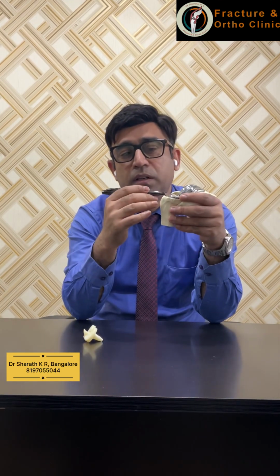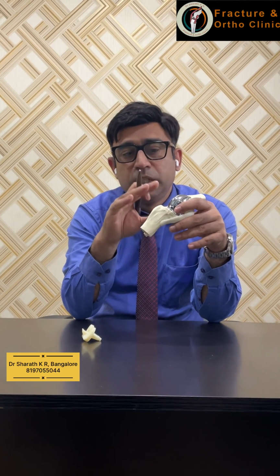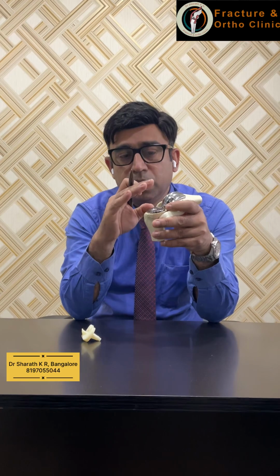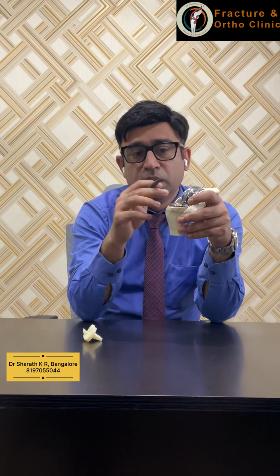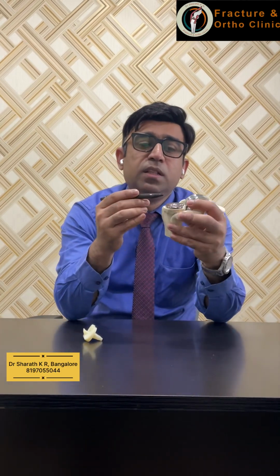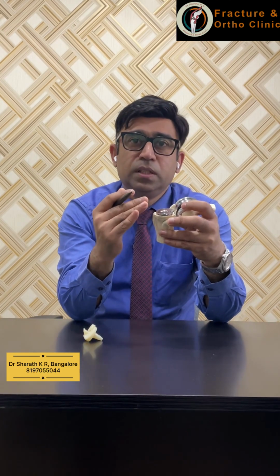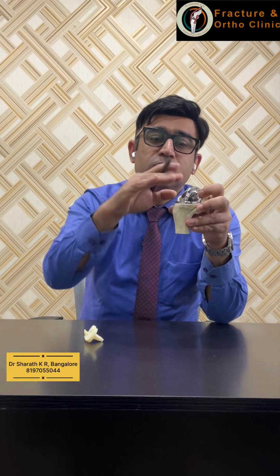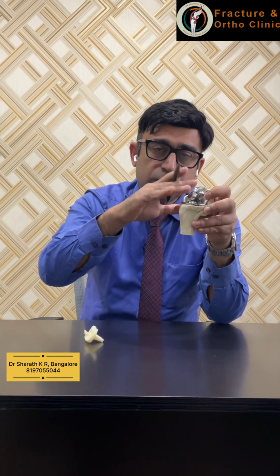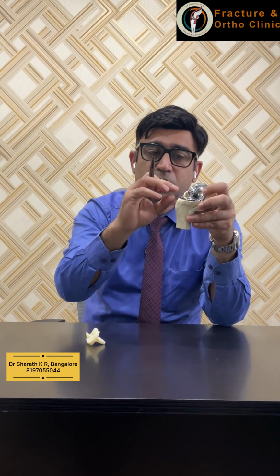We do something called resection of the bone in order to put the implant of the tibia and femur. In this particular tibial cut, the first point is that we can increase or reduce the slope up to whatever is the native slope of the particular patient, and we can increase or reduce the tilt of this base plate, and we can increase and reduce the thickness of this resection up to 1 mm.